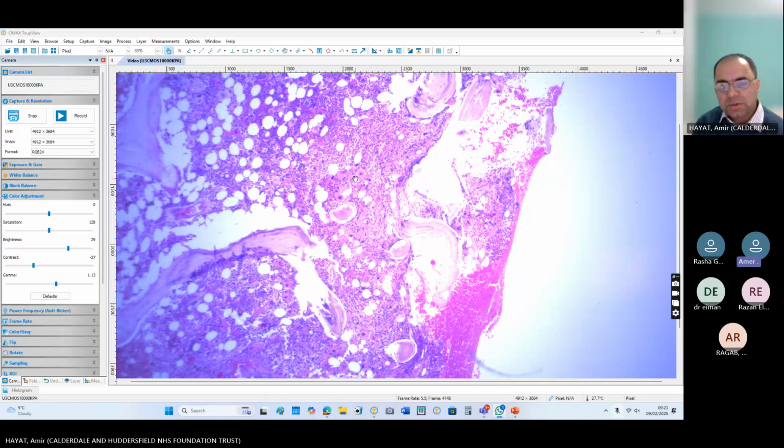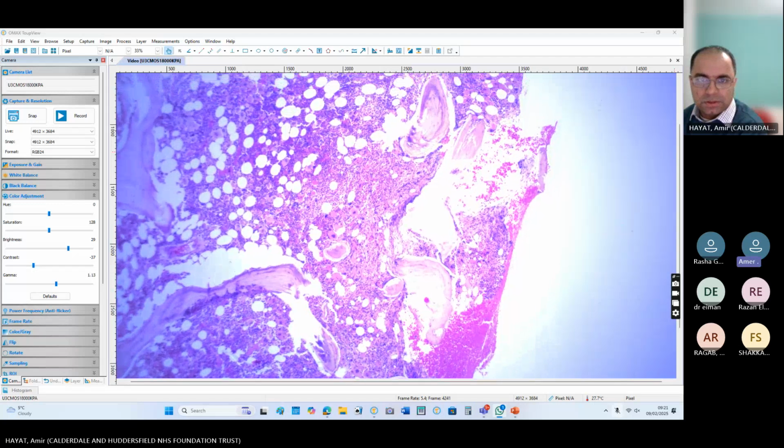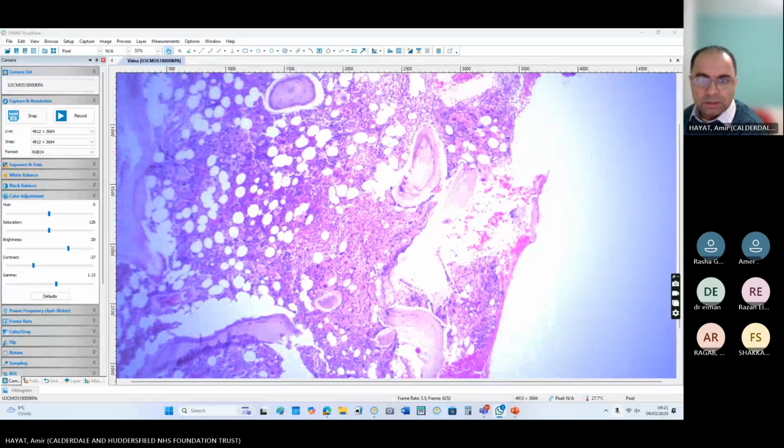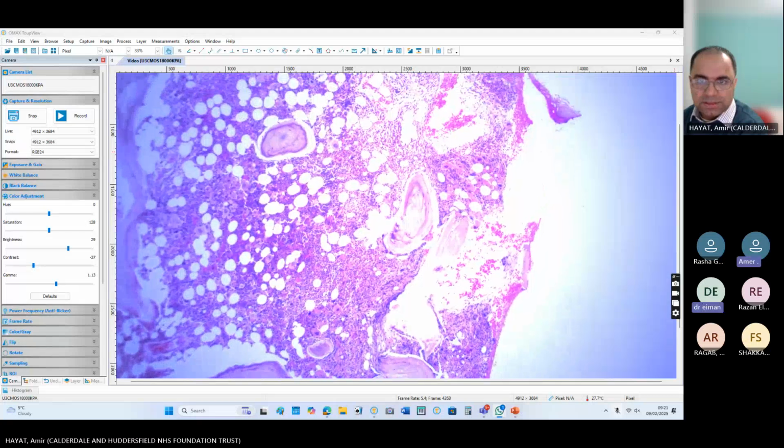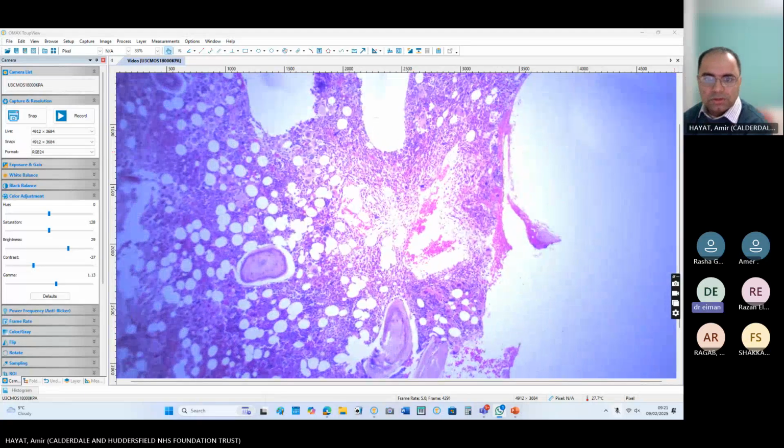These megakaryocytes are small. They are not small because they are a feature of myelofibrosis. They are small because they are squeezed between the fibers. Small megakaryocytes are a feature of CML and MDS with 5q deletion only. The rest of the conditions have normal megakaryocytes. So still, if you cannot pick it up on this one, they will give you the reticulin.